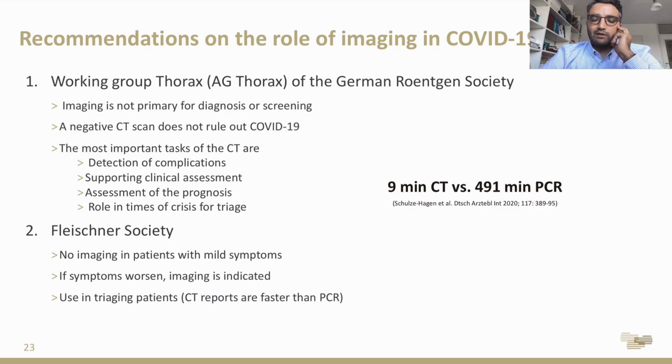The same thing was recommended by the Fleischner Society. The Fleischner Society is an international multidisciplinary medical society for thoracic imaging. They recommended the use of CT at peak times because CT reports are faster than PCR.